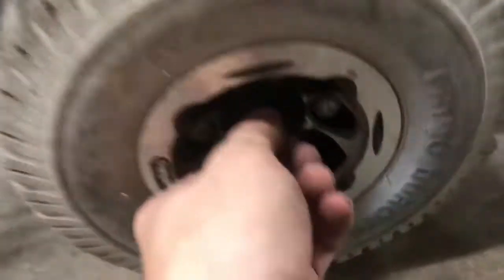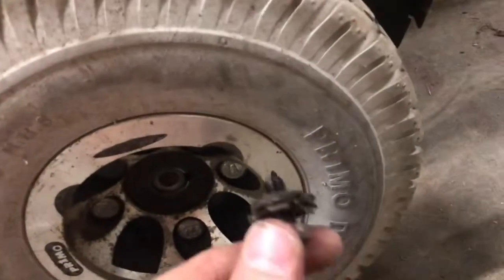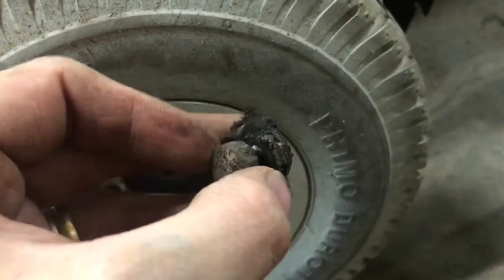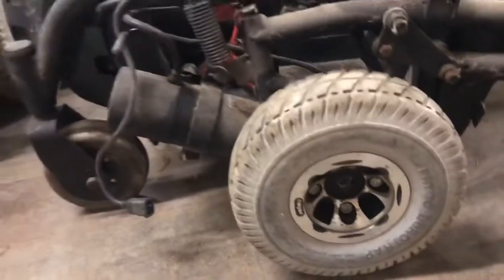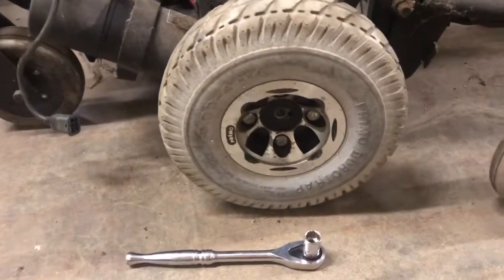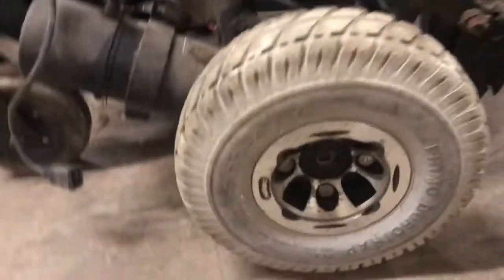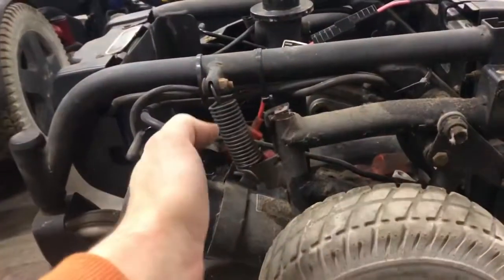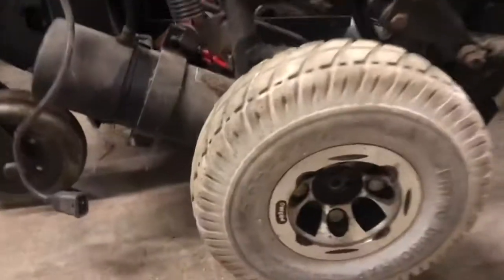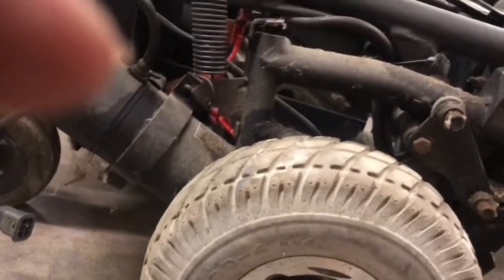Okay, so now I'm able to unscrew this. Okay, this is what it looks like. You can see it a little bit better. Okay. So this is a mid-wheel drive chair, so the wheel is pivoted to the middle. So when you take the tire off, sometimes they kind of crumble in the middle because that's just the way they're set up. You see the spring. So I usually prop the tires on something.